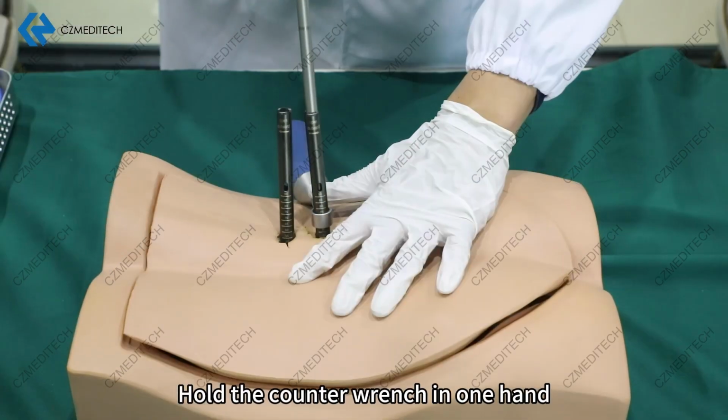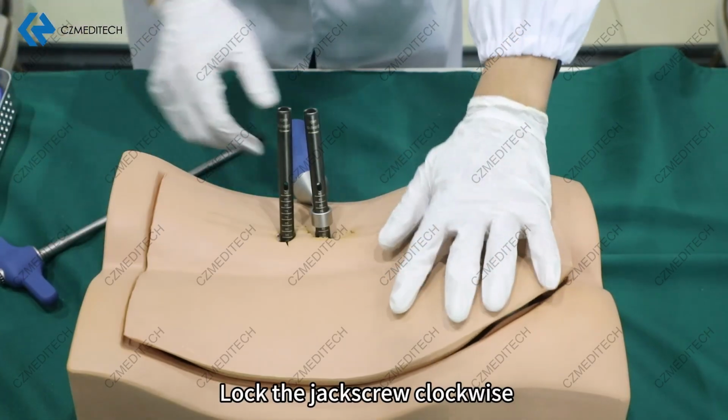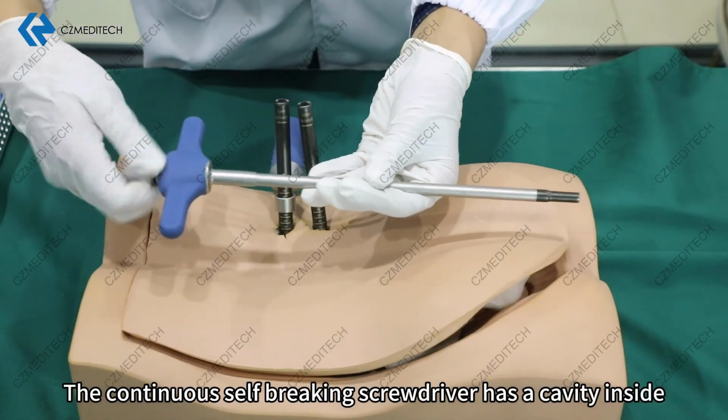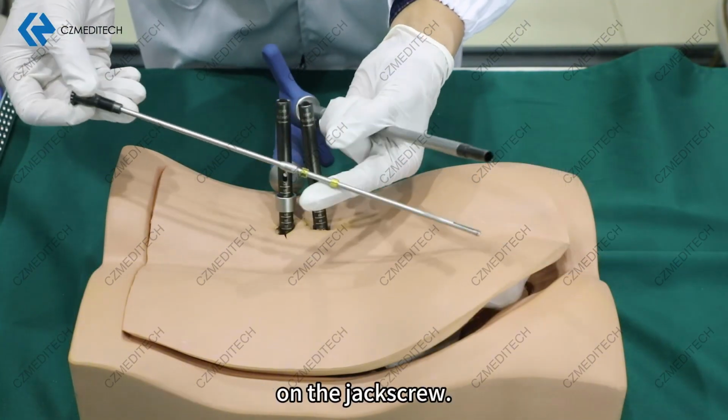Hold the counter wrench in one hand and the self-breaking screwdriver in the other. Lock the jack screw clockwise until the tail of the jack screw breaks. The continuous self-breaking screwdriver has a cavity inside, which can continuously carry out self-breaking locking operation on the jack screw.